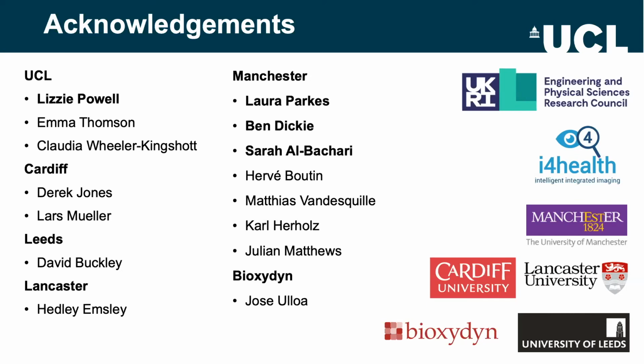Makes sense. That's helpful. On the diffusion-based method, it does seem a lot of the underlying assumptions of the model are related to this kind of IVIM component for your assessment. I was a little surprised looking at the graphs that on the diffusivity measured using the relaxation corrected model, it seemed like the white matter was greater than the gray matter. You might have imagined if it's IVIM based, whether it's volume or flow related, it might actually show the opposite. Do you think, in more general terms, that an IVIM-like model has limitations in this application, or in practice, does it seem to be good enough?